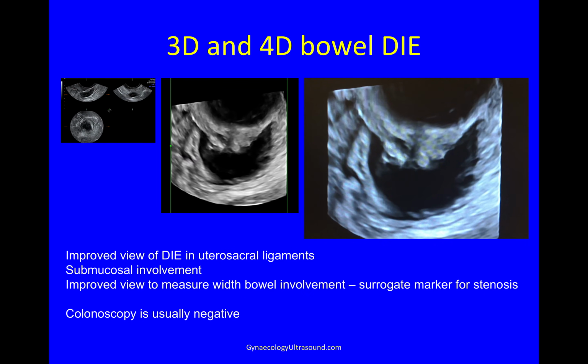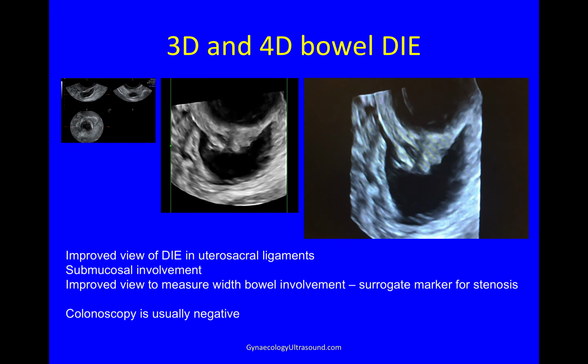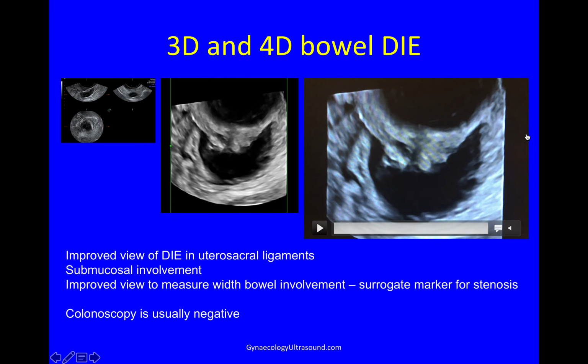If you rotate your image around, it gives you a slightly better idea that this lesion, as you can see, is very, very retracted, and might well be causing significant stenosis.